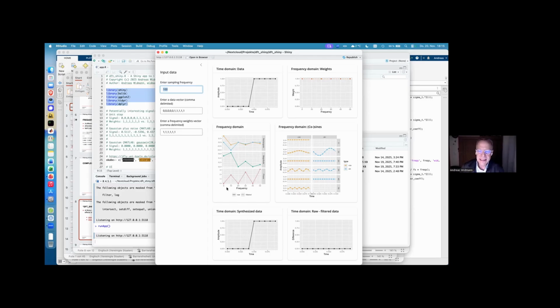And the idea of filtering is now putting, in the frequency domain, a weight on each of those frequency components. So we additionally have a weight vector, which typically is either 1, so we do not change the amplitude of that frequency component, or it is 0, because we want to remove the noise parts, which completely attenuates that frequency component.